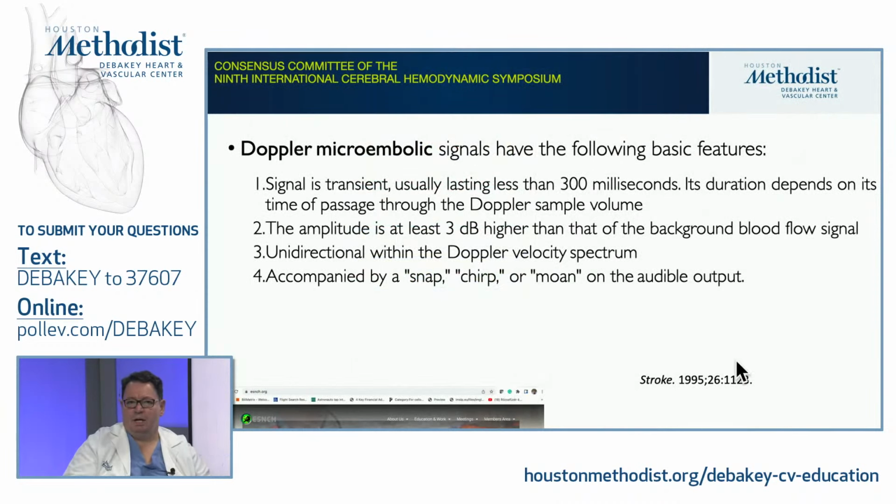And here you go. This is one of the first consensus documents with the Europeans, ESNCH, the European Society of Neurosonology and Cerebral Hemodynamics. We are trying to revise these, and hopefully within a year we'll have a new consensus of the microembolic signal definition.